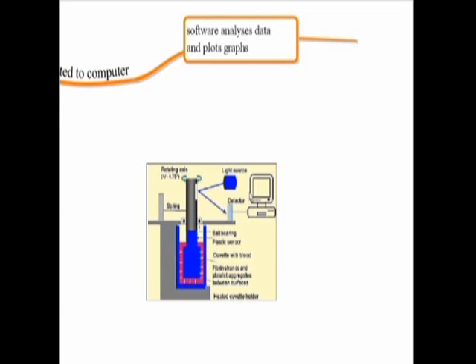And then once the clot is formed, it stabilizes, and then it starts breaking down, because the clot is not going to last forever. Once it starts breaking down, it starts recording that on the graph as well. So imagine we've taken the sample from the patient like 2 minutes ago. You put it in here.